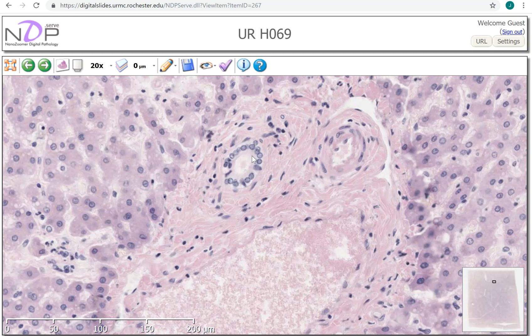You may see one profile of the bile duct like what we have here, or you may see a couple of different profiles throughout the portal area. About twenty percent of the portal triads or portal tracts won't have any bile ducts evident in them, even though it's not a ductopenic liver or one that has any loss of bile ducts.